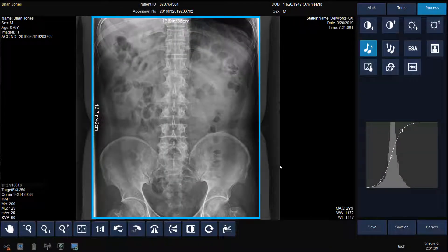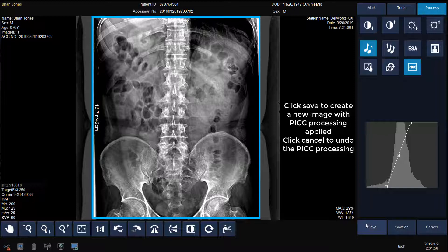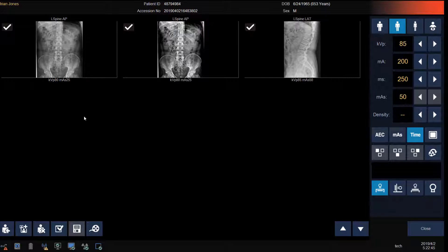Or click the PICC tool for enhanced image processing. The new PICC tool improves visualization of tubes, lines, and leads by applying an enhanced processing algorithm, which is especially useful in mobile imaging. Click on the PICC tool to apply the enhanced processing. Click Save to create a new image with the PICC processing applied, or click Cancel to undo. After clicking Save, we return to the acquisition screen and now we have two AP lumbar spines — one with the original processing and one with the new PICC line processing — so both images can be sent to PACS together.